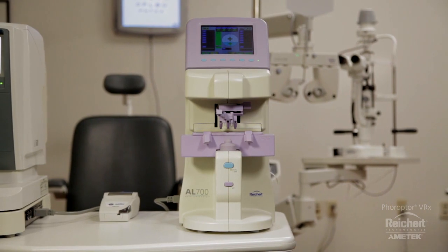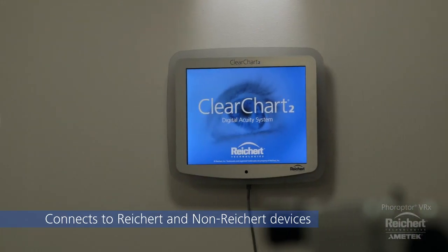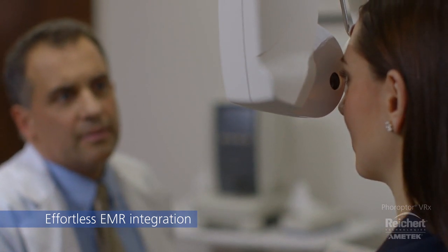Feropter VRX seamlessly connects to Reichert lensometers, autorefractors, and acuity systems, along with a comprehensive list of non-Reichert compatible devices. Feropter VRX integrates with an extensive list of EMR systems, removing the risk of transcription error and increasing patient throughput.